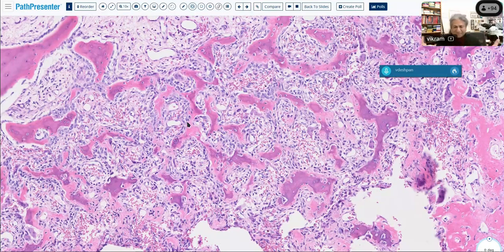But the classic bone formation, somebody suggested a diagnosis of osteoma. Osteoma is a surface lesion, right? It's stuck on the surface. If it's intramedullary, it's not an osteoma. The second one is an osteoid osteoma, an osteoblastoma, and someone very helpfully pointed out the difference between the two is simply size. And then there's only one malignant bone-forming tumor, and that is osteosarcoma, right? There are other instances where you can have malignant bone formation, but we won't talk about that right now.